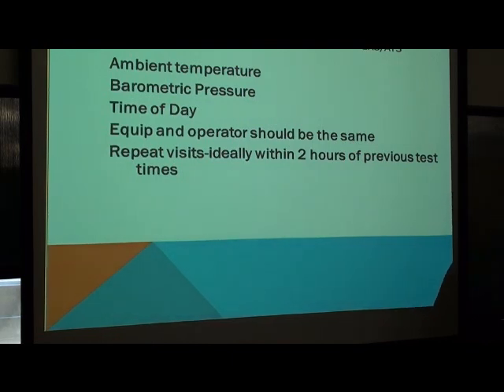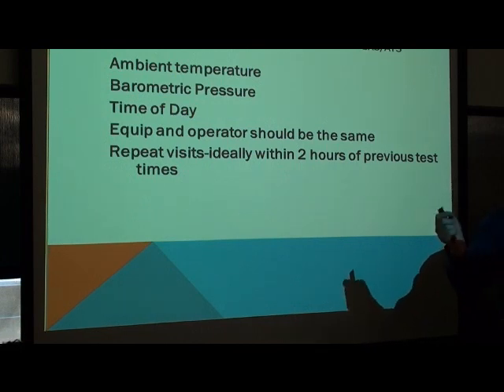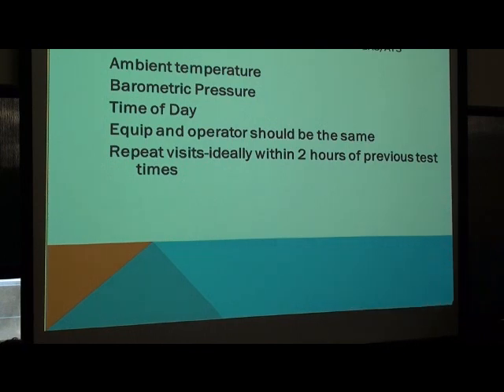And we know that this is used to convert the measured volumes. The computer's going to do this for you when you do your collections, from ambient temperature and pressure conditions to what it would be in the lungs, what we call body temperature and pressure saturated with water vapor, so BTPS. So a technical detail, but an important one.